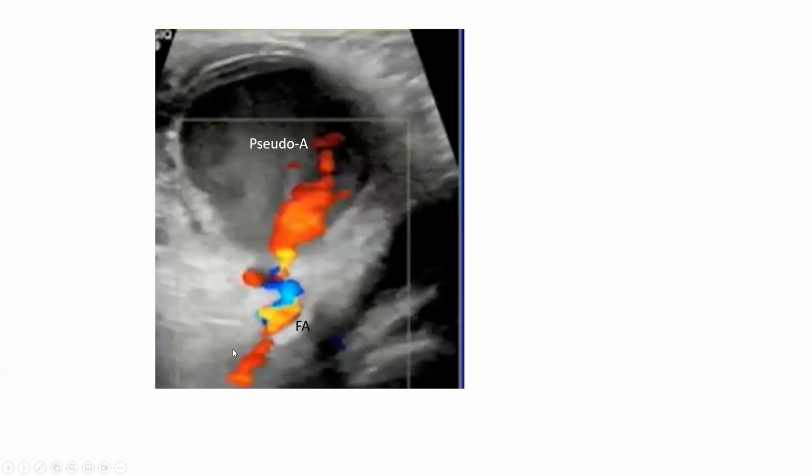flow. And this is an illustration. You will see the femoral artery and you see that collection that is black, okay? It's like a cavity. It's not a hematoma that has a clot and is more whitish. It's black and there is a communication. There is flow into it. And it's to and fro. There is flow both ways, this way and that way.